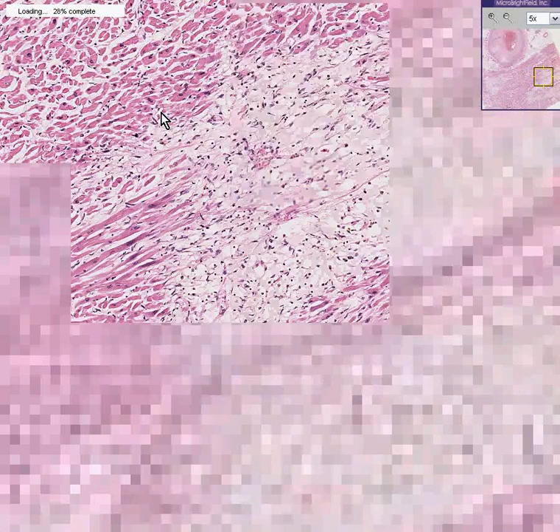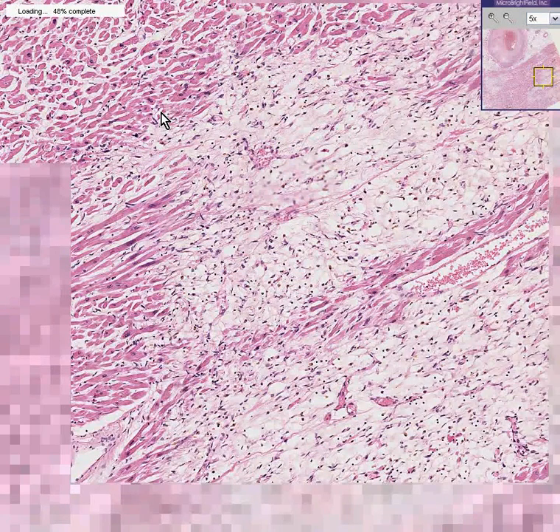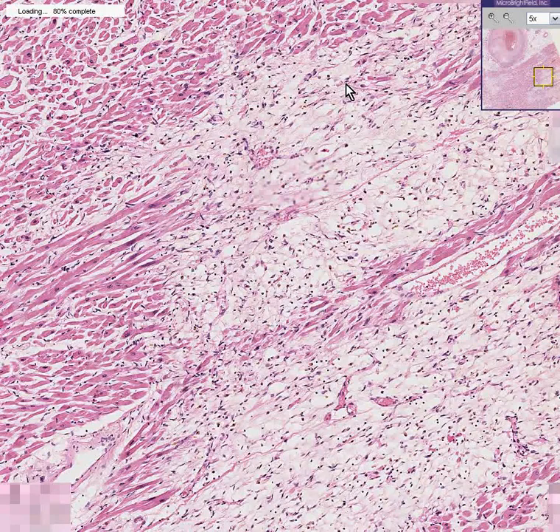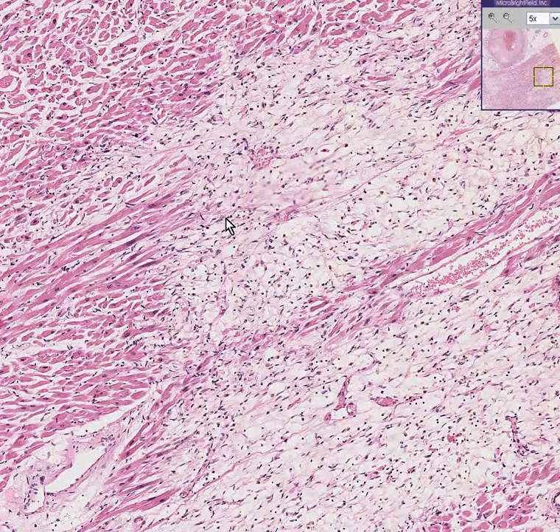The main picture that we see here, these whiter areas within the myocardium, consist of a lot of blood vessels, like here and here and here and here. And most of these white cells are white because they are histiocytes. They're foamy histiocytes. So in the organizing phase of infarction, like the organizing phase of inflammation anywhere, you can have an ingrowth of these macrophages or histiocytes, soon followed by budding endothelial cells and blood vessels here.